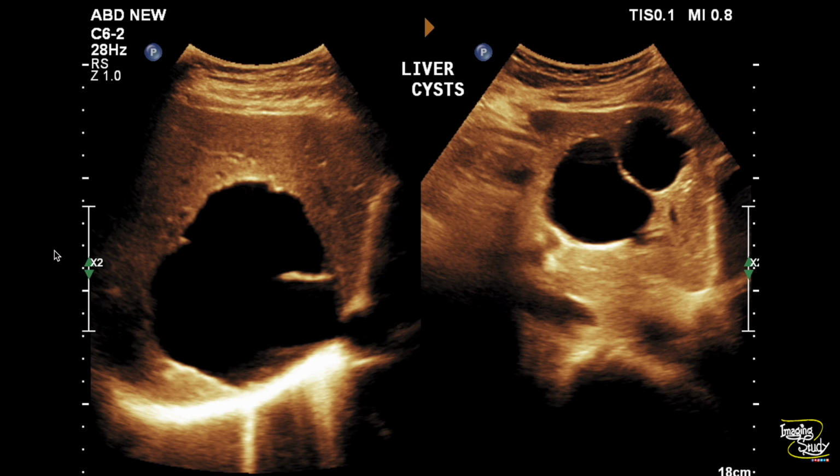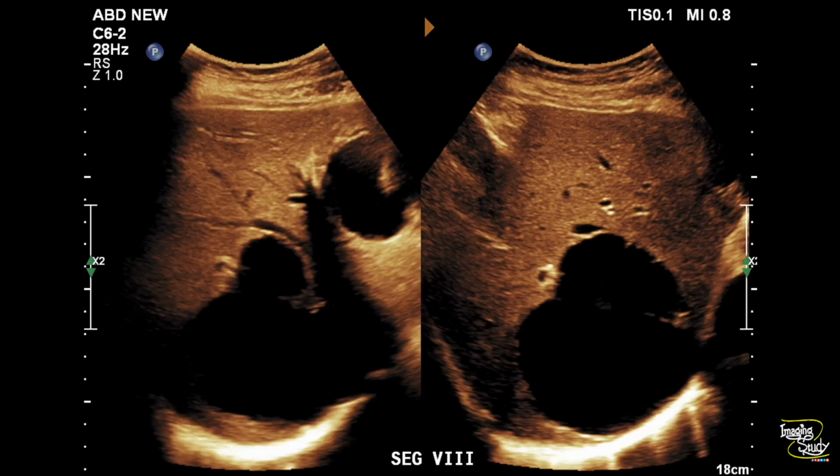Here is again another large cystic lesion. This patient had multiple hepatic cystic lesions, and you can see some septation inside. Another picture of this patient involving multiple segments. Let's jump into the real time.